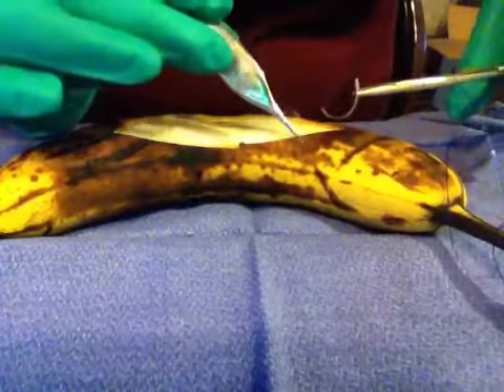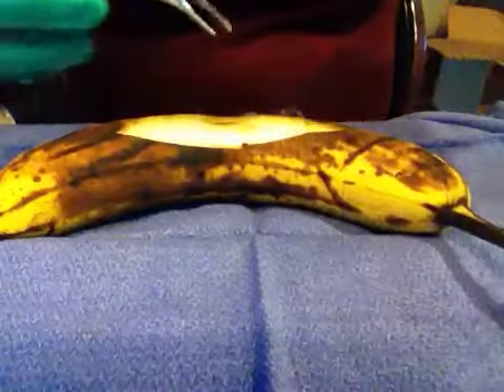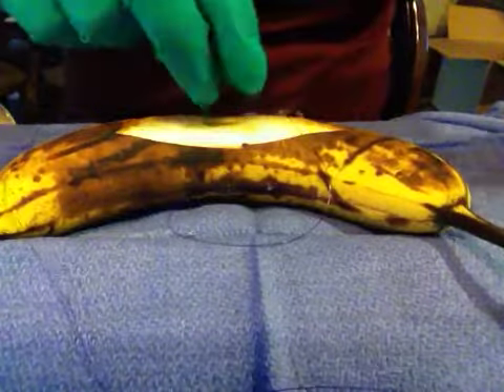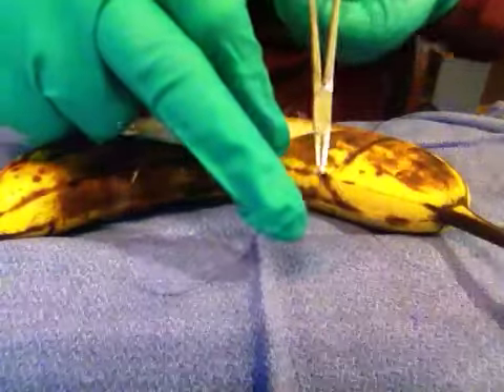Okay, today we are doing a stent dressing. This is when you have sutures that are on one side, and you leave sutures on one side and then you put gauze in the middle.